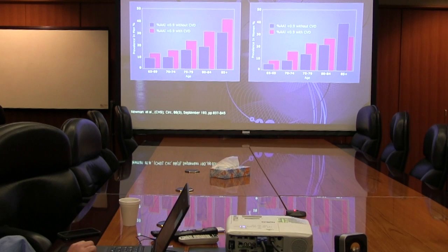Are regular ABIs okay in that setting? Or would we need to walk them? I think that's a great question. So what she's getting at, and we'll talk about a little bit in a few slides, is patients who have symptoms of claudication but normal rest ABIs, you're not done. You've got to do exercise ABIs.